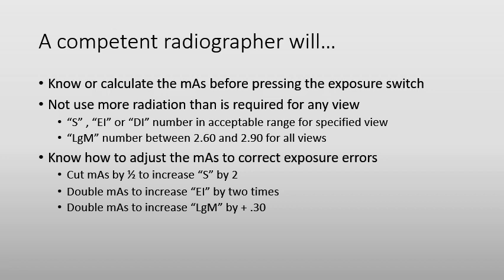Whether or not your equipment supplies mAs calculations, the responsibility is yours to calculate the mAs before pressing the exposure switch.